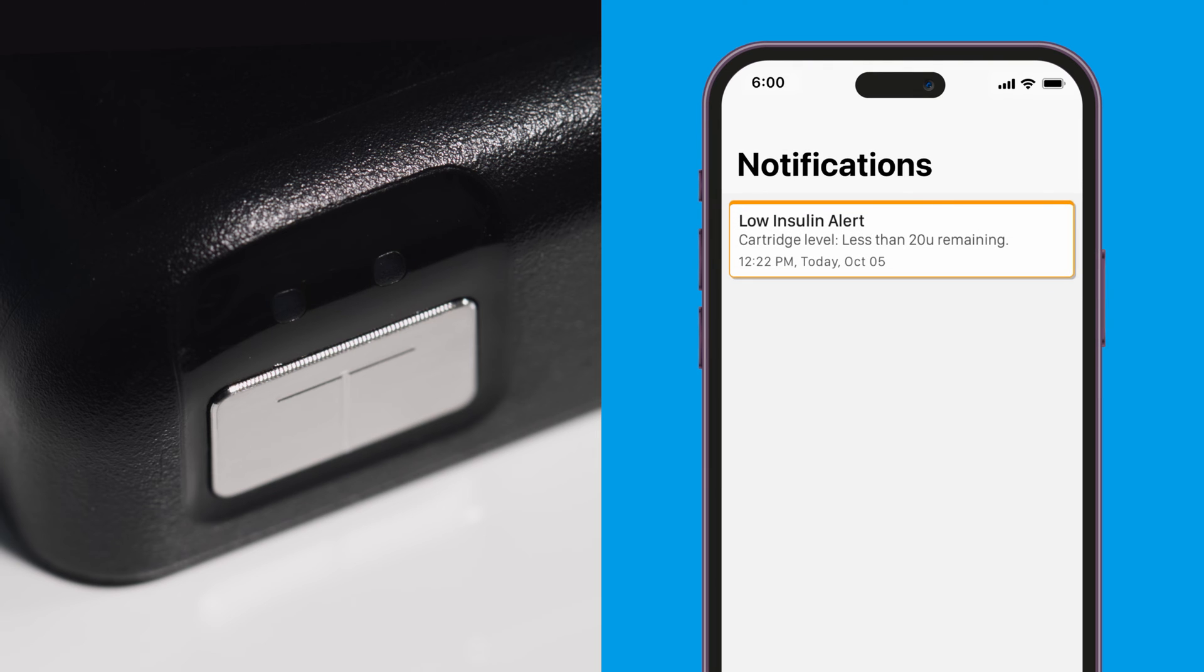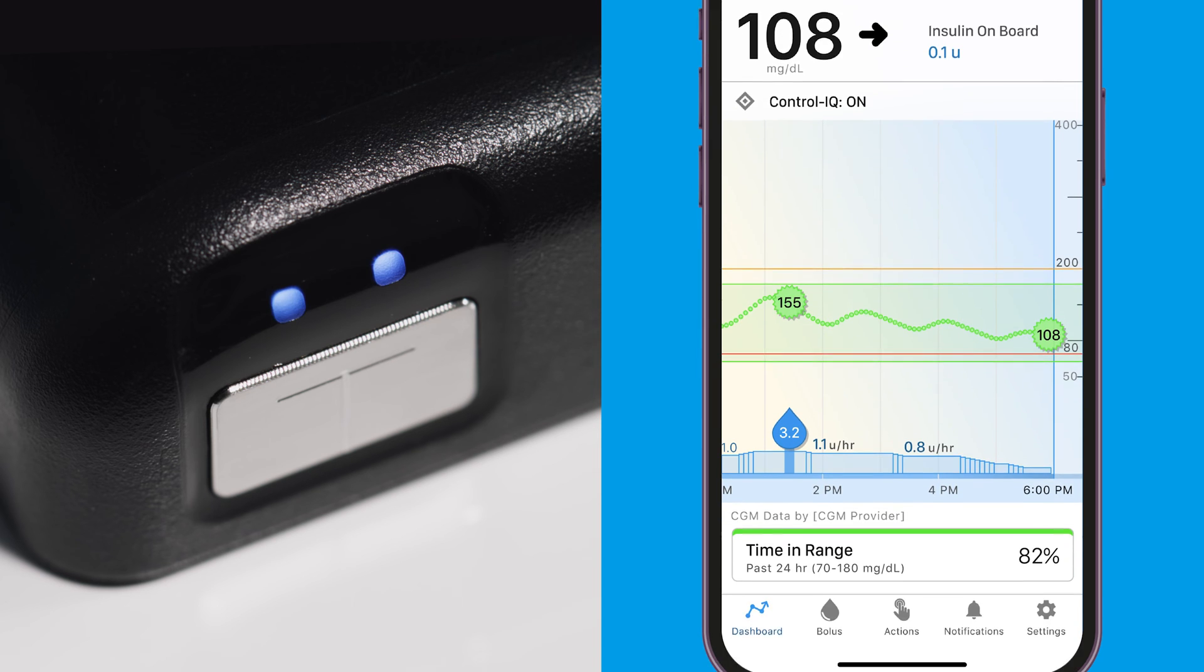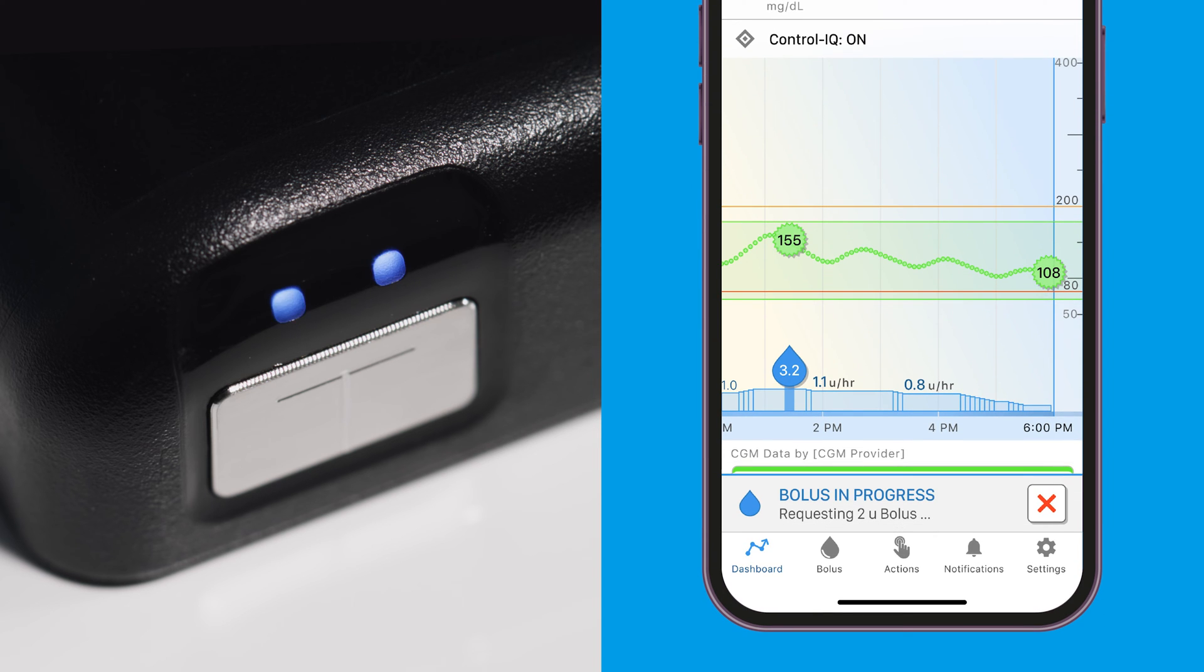Yellow represents an alert or a reminder, such as a sensor expiring soon or low battery. Blue represents bolus delivery or the tubing being filled during the cartridge loading process.